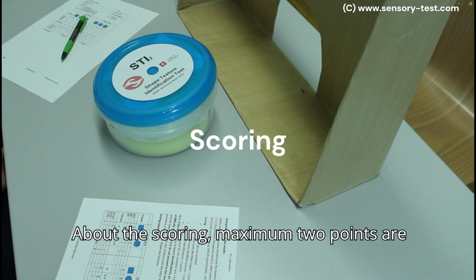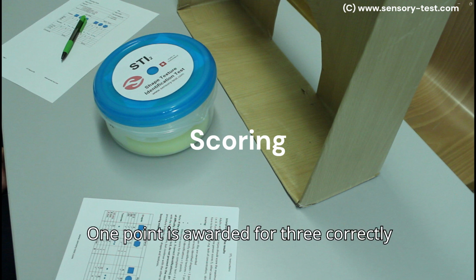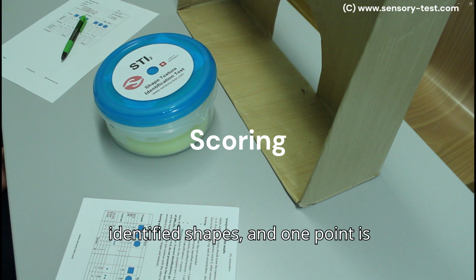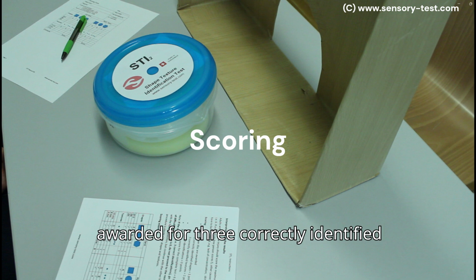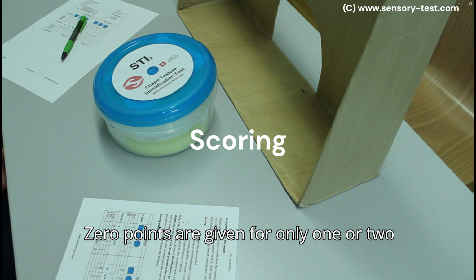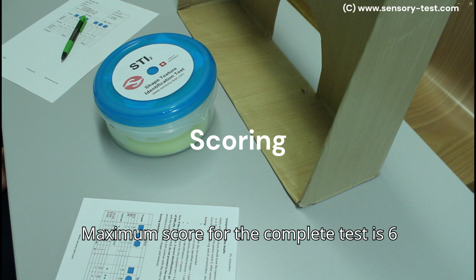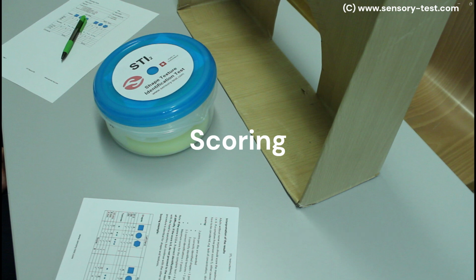About the scoring, maximum 2 points are awarded per disc. 1 point is awarded for 3 correctly identified shapes, and 1 point is awarded for 3 correctly identified textures. 0 points are given for only 1 or 2 correct identifications. Maximum score for the complete test is 6 points.